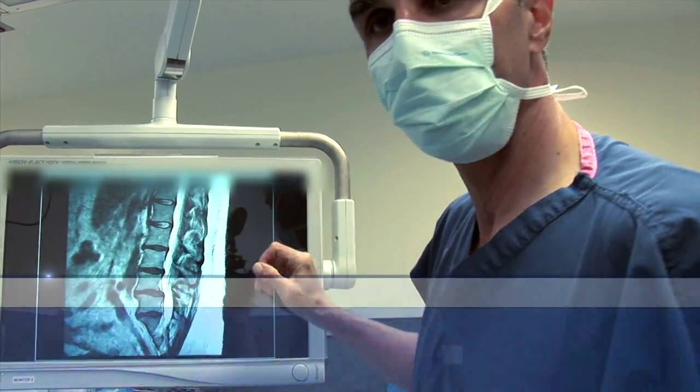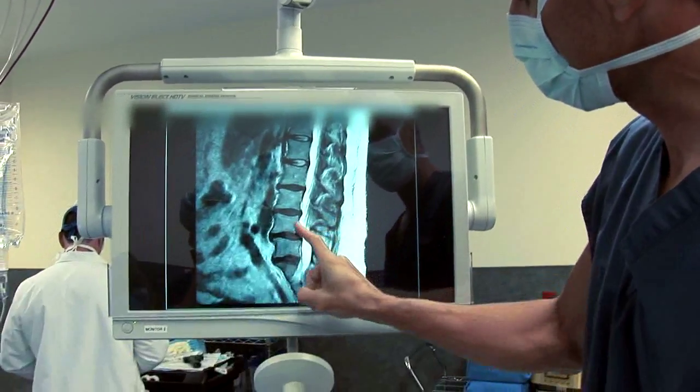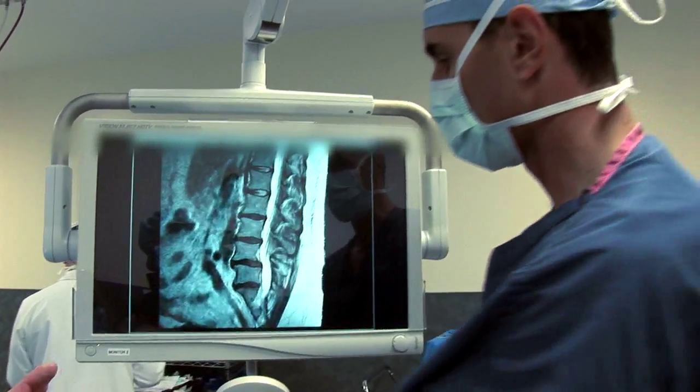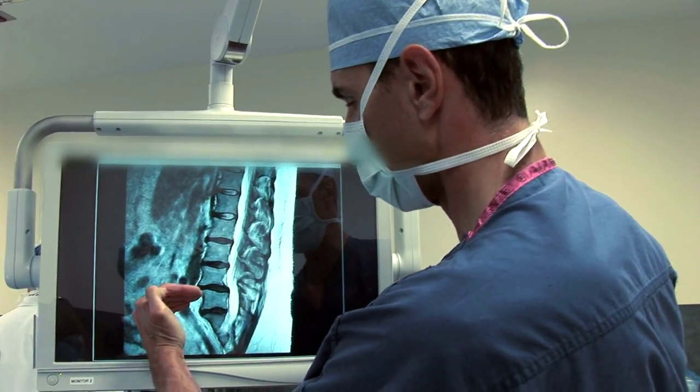This is our case today — a patient with back pain and spondylolisthesis. The L4 vertebral body slips forward on the L5 vertebral body. We're going to go in anteriorly and do the anterior lumbar fusion that you're familiar with from prior videos.